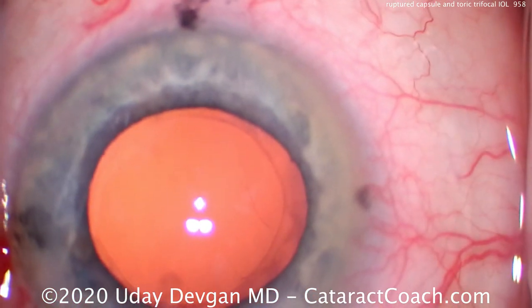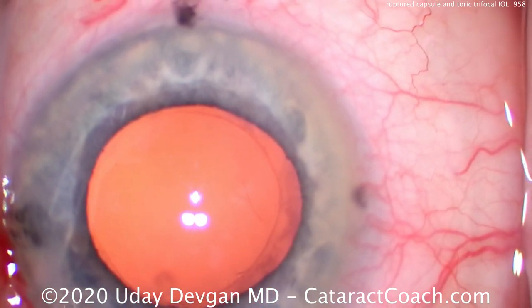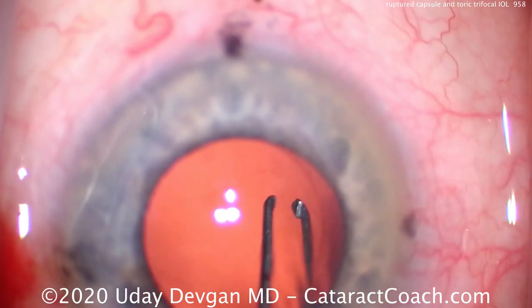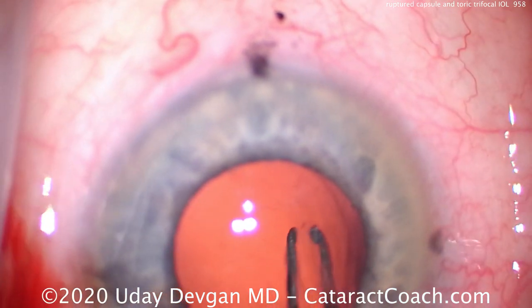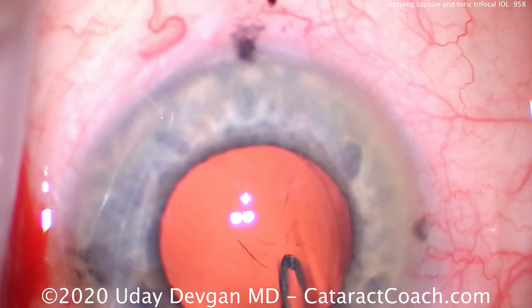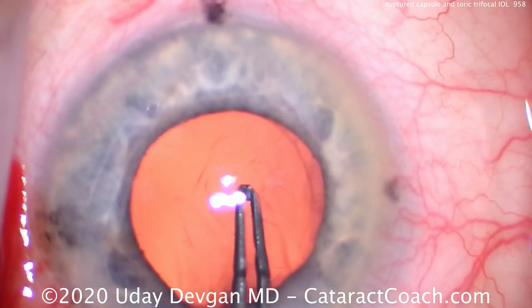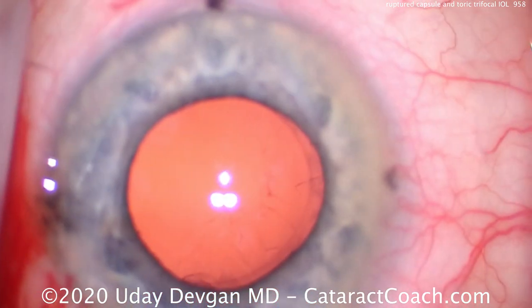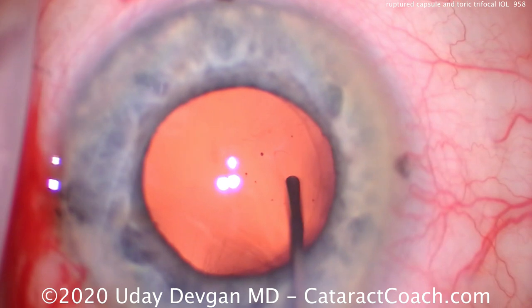Now let's see where's that break and can we turn that into a posterior capsulorhexis? Because that'll have no weak edges. So we're going to try — with the eye full of viscoelastic — to get the edge of this with our capsulorhexis forceps and create a small round opening from it. We don't want that irregular edge. This is a good technique but it can't always be done. In this case we really couldn't convert it to a posterior capsulorhexis.